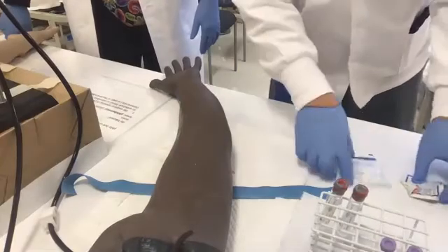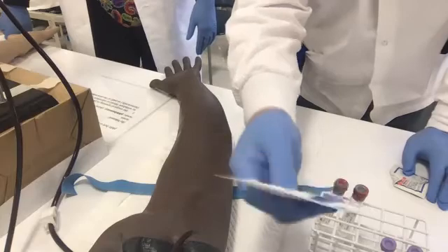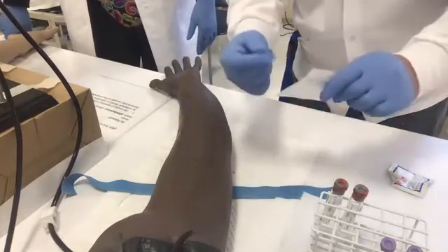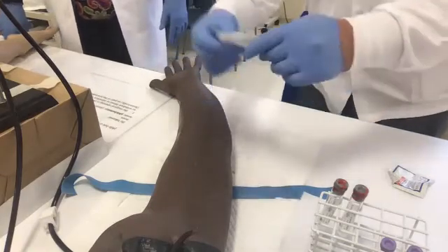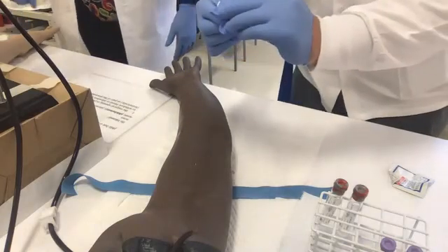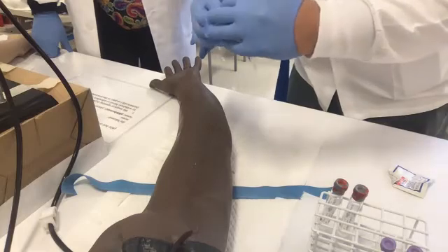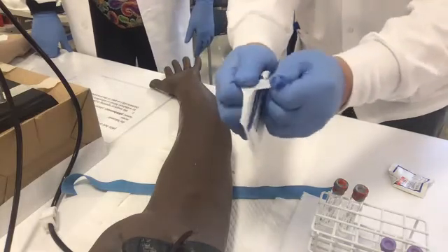I also have sterilized gauze sponges, either 1 by 1 or 2 by 2. They could also be in a pack. And remember, don't dig your grubby little hands in the pack. You always have a gloved hand, right? Here, I open it up, and it's more challenging when you have gloves on. You open it up like a banana.